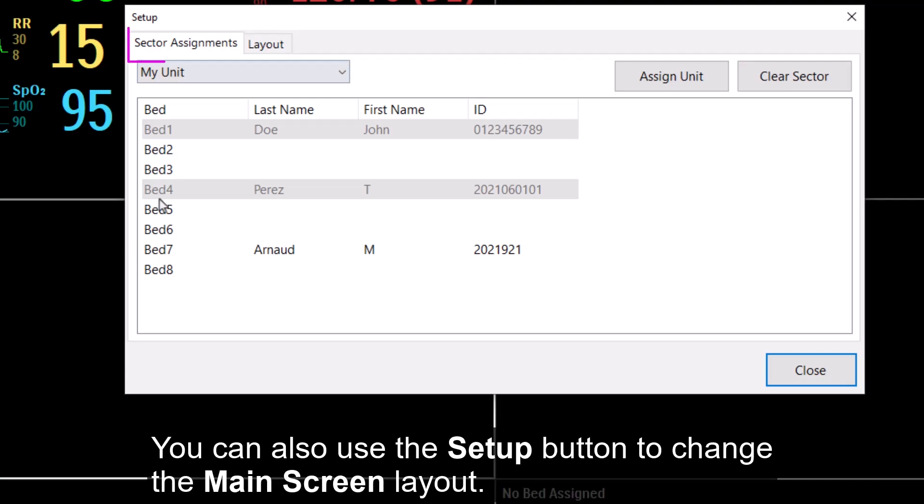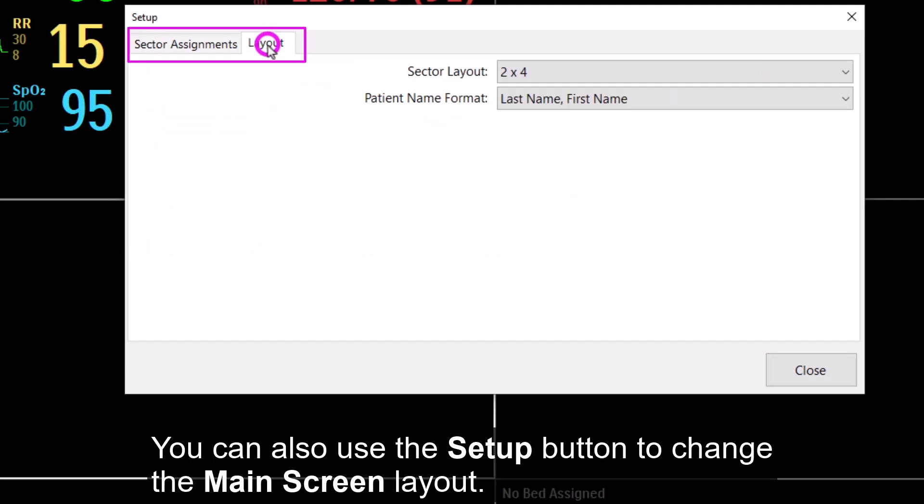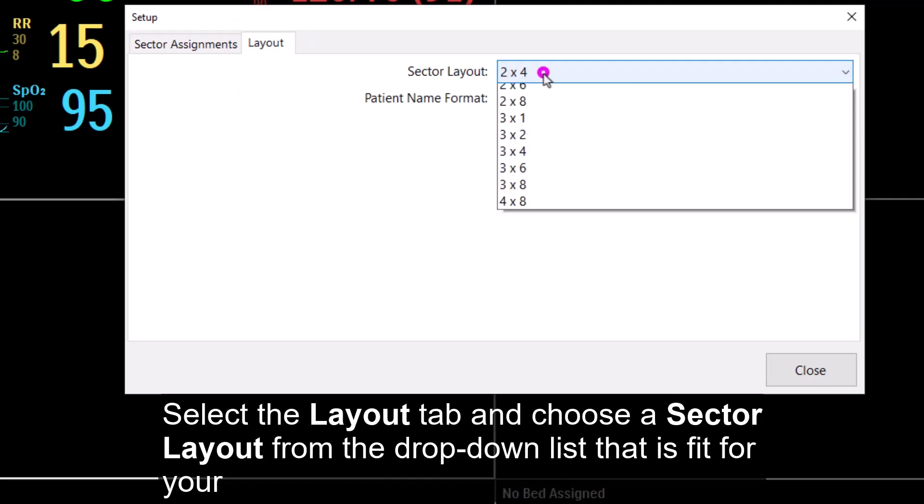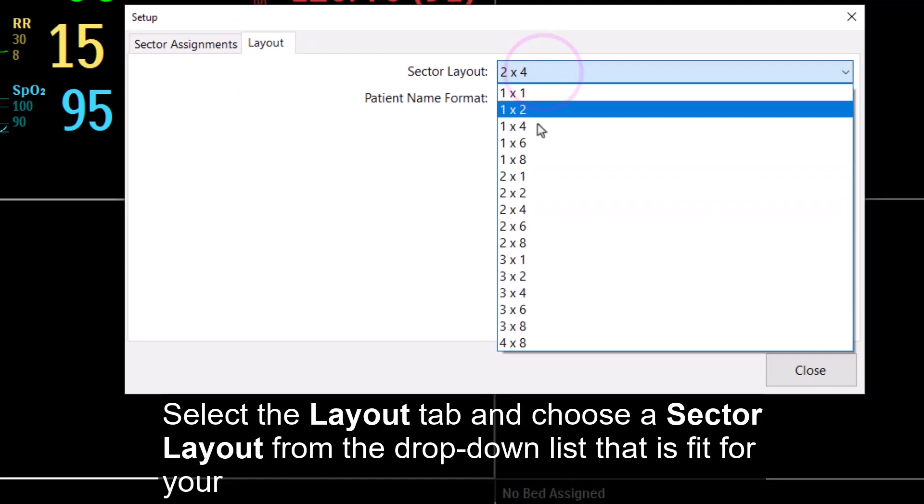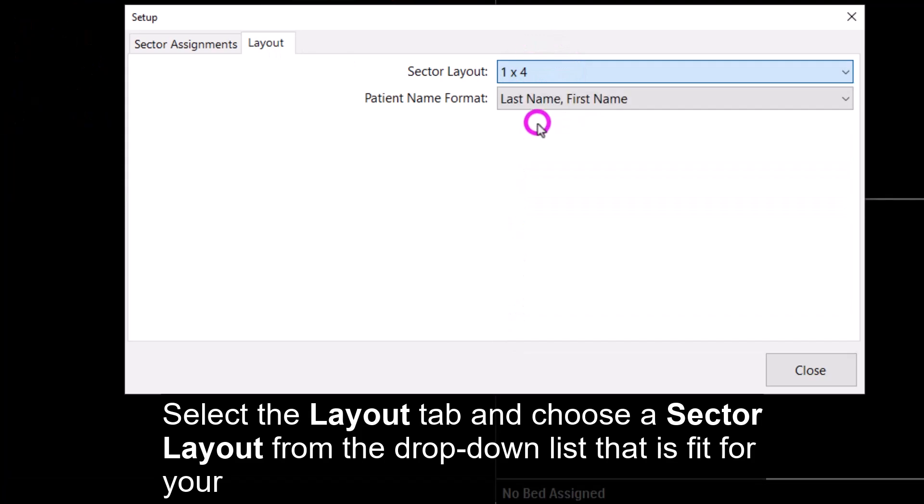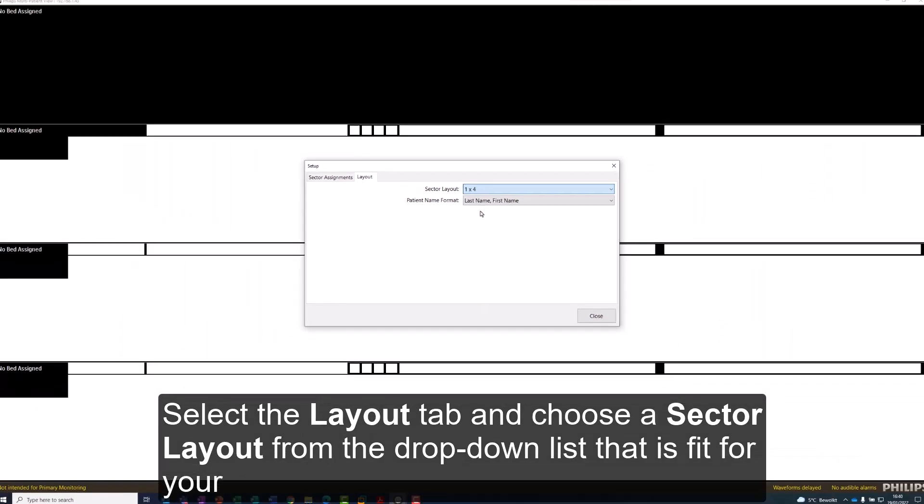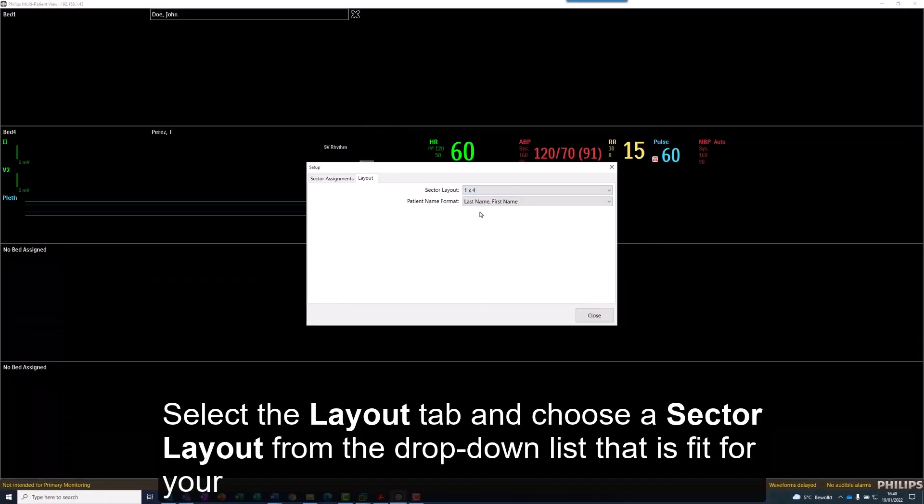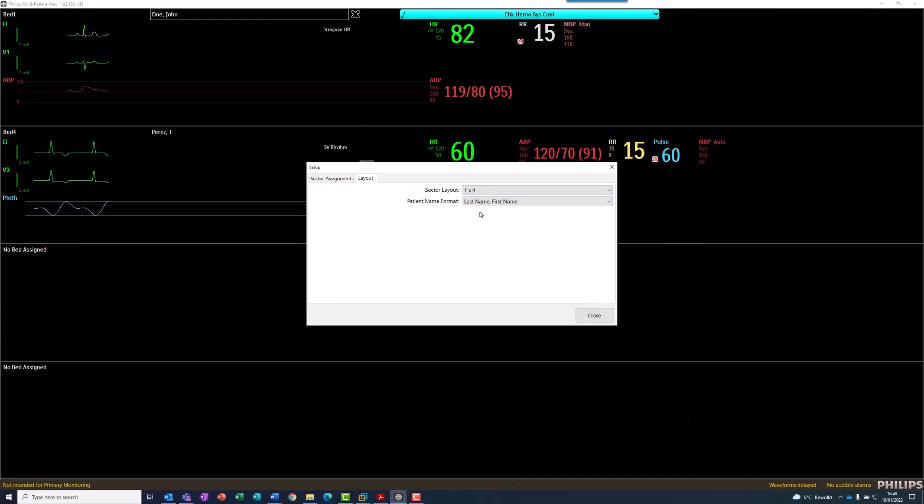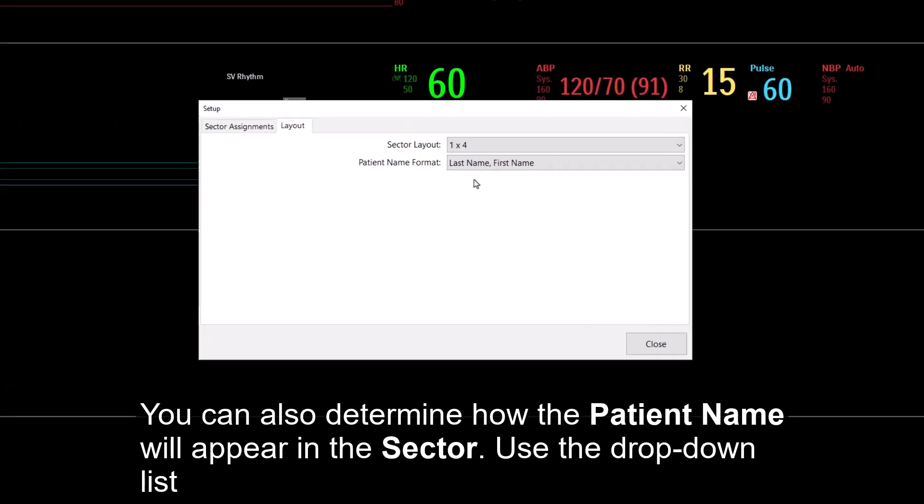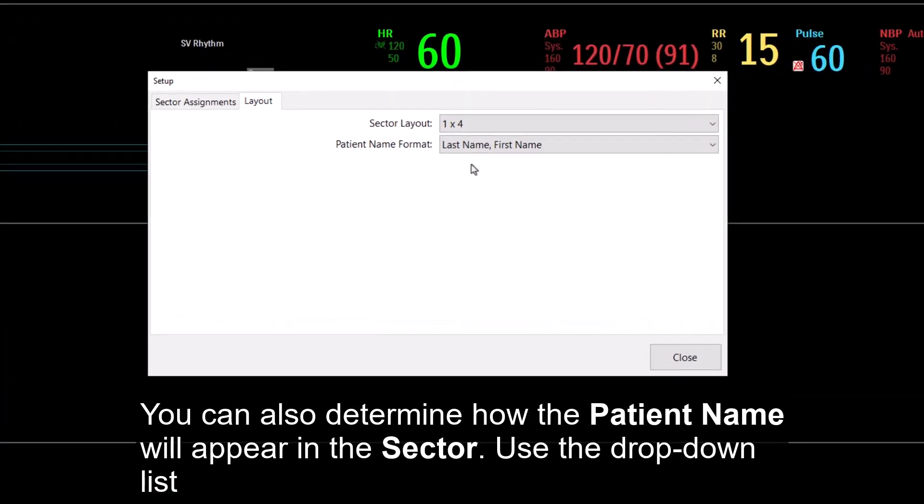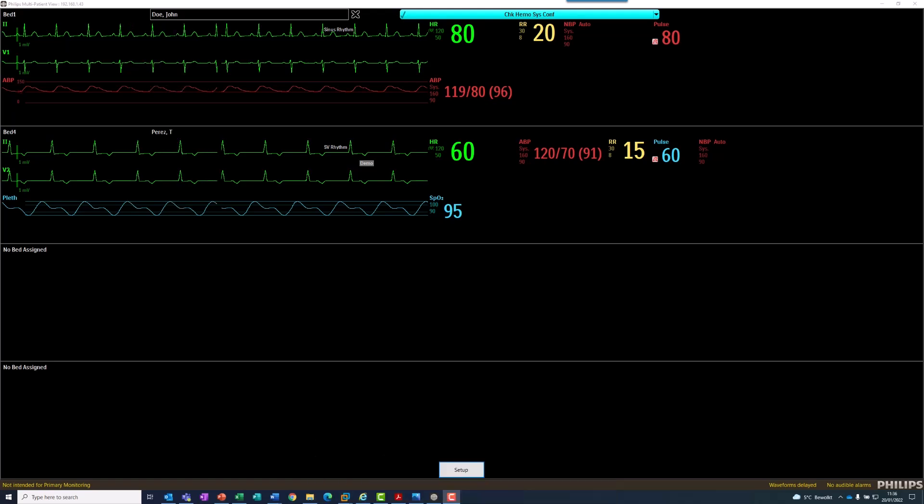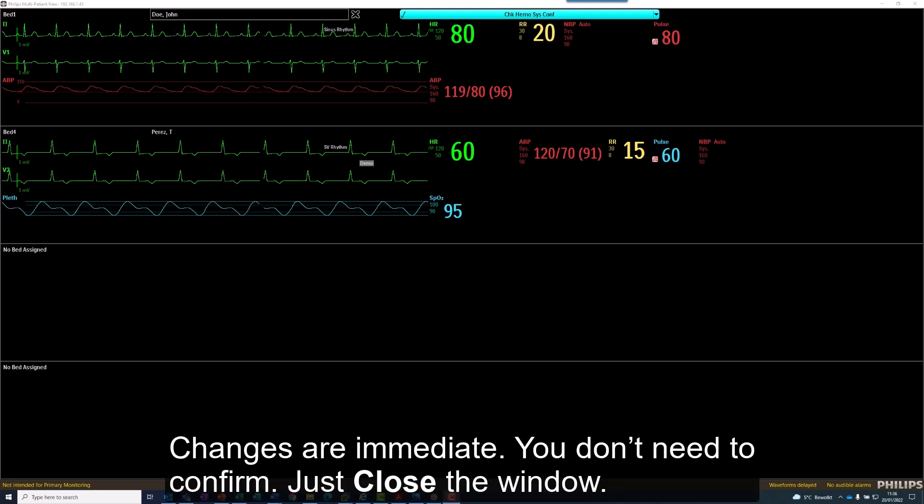You can also use the Setup button to change the main screen layout. Select the Layout tab and choose a sector layout from the drop-down list that is fit for your screen. You can also determine how the patient name will appear in the sector. Use the drop-down list to change the default. Changes are immediate. You don't need to confirm. Just close the window.